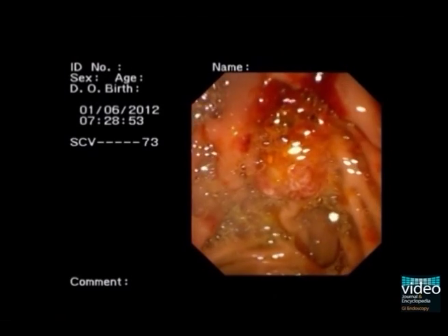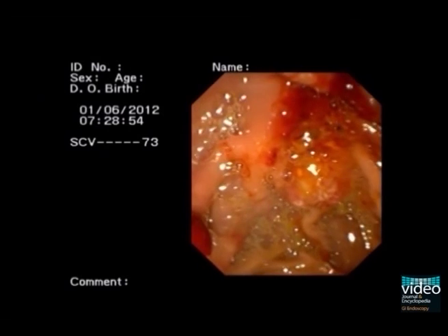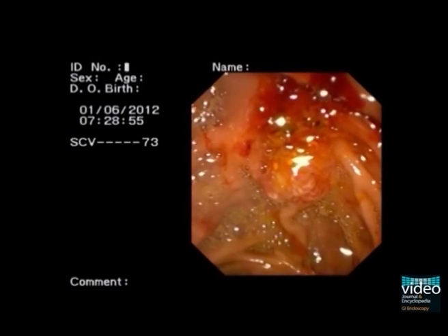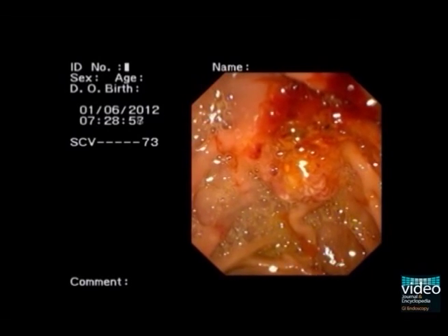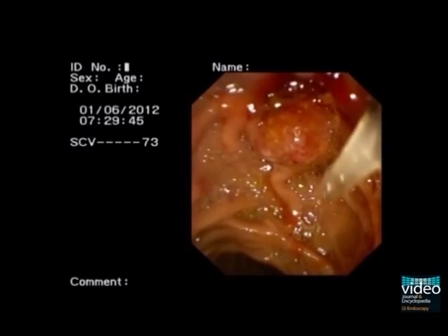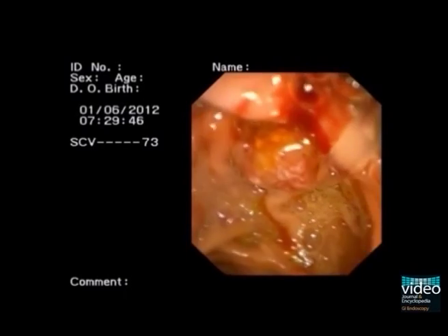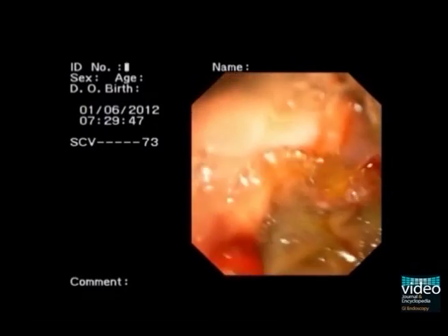An endoscopic image of the ampulla of Vater with the previous sphincterotomy. Cannulation with the CRE balloon.